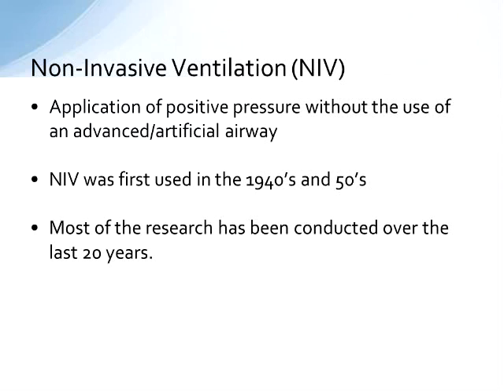During that time, non-invasive ventilation continued to be used, mostly for patients with neuromuscular disorders. But it really wasn't until the last 20 years or so that we've seen a resurgence of this technology, not just in adults but also in pediatric patients, with most of the research being conducted over the past 20 years. Of course, the major driving force behind the use of non-invasive ventilation for all populations has been the desire to avoid all of the adverse complications that have been associated with invasive mechanical ventilation.